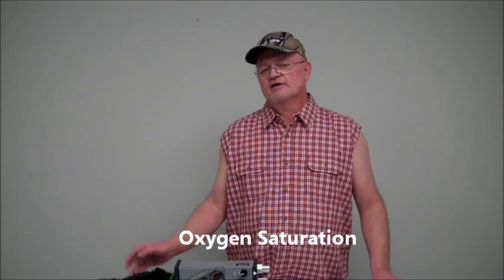Last time we talked about initial ventilator settings: FiO2 at 100%, a PEEP of 5, a respiratory rate of 12, and a tidal volume of 8 cc's per kilo. Today we're going to talk about oxygenation and ventilation. When we're talking about oxygenation, we're talking about the PaO2 on the blood gases or the oxygen saturation on the pulse oximetry. So if a patient is hypoxic, we can do two things.